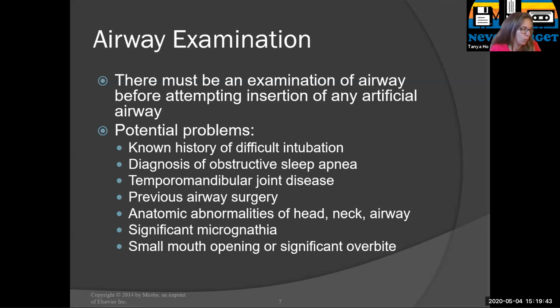So one of the terms I talked about, an emergent intubation, the other term they call it is rapid sequence intubation, or RSI. So make sure you're familiar with that term. A rapid sequence intubation is not going to be able to do all of this. It's kind of an emergency scenario, and basically they're just going to go ahead and stick the tube in without performing the ideal scenario of a full airway exam. But a rapid sequence intubation is typically where you get all your supplies ready, they go ahead and sedate and then paralyze the patient.